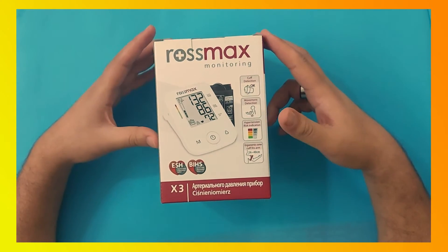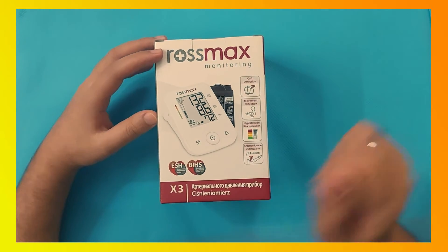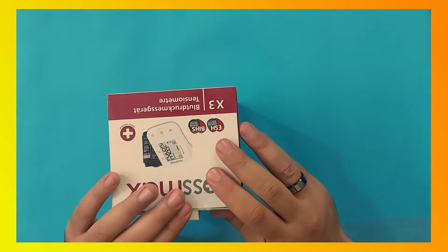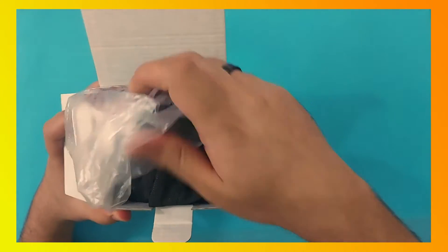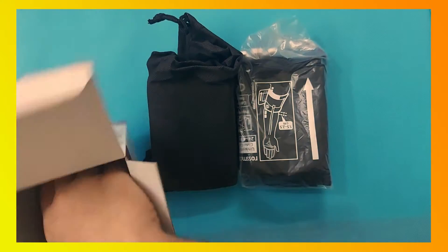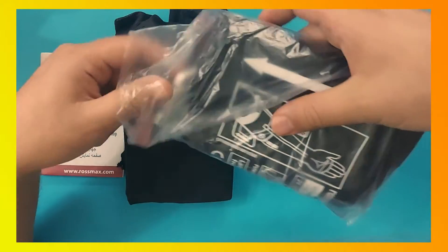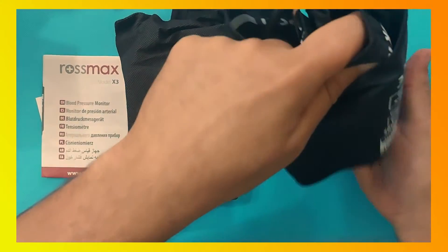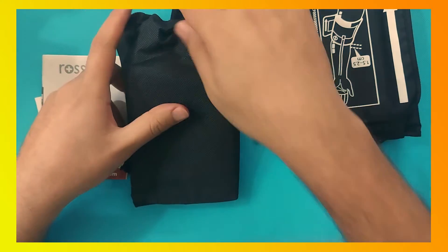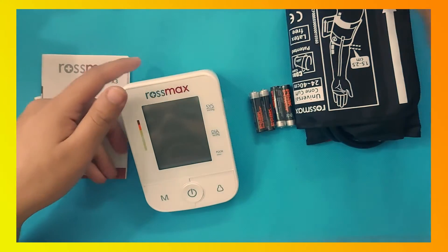Hi there, this is the Rosemax blood pressure monitor — the new model Rosemax X3. Let's unbox and see what's inside. In the box, as you can see, this is the inflation cuff. These are the booklets. The inflation cuff is big in size; it's suitable for people with big arms. This is the monitor, closed in a pouch.